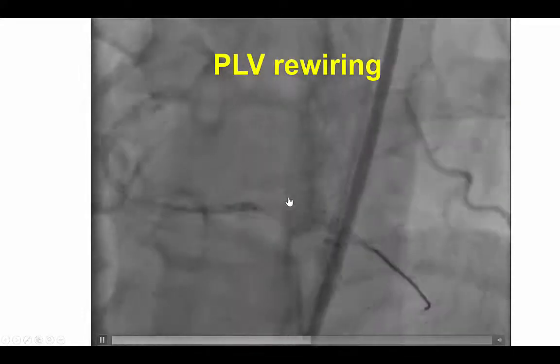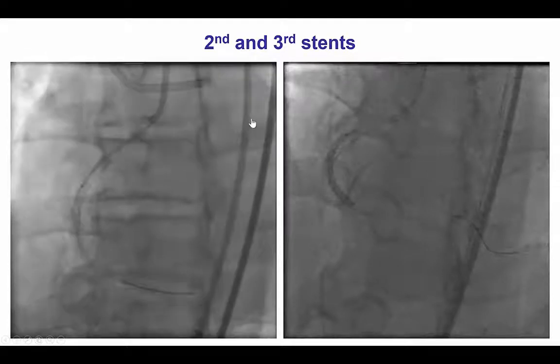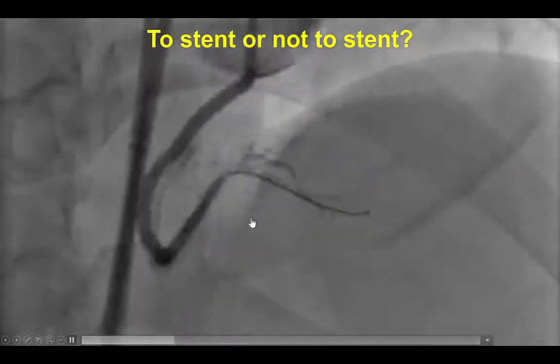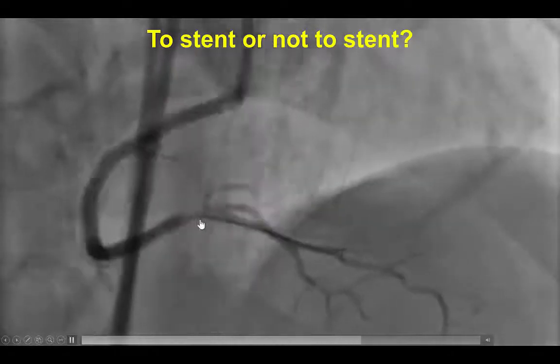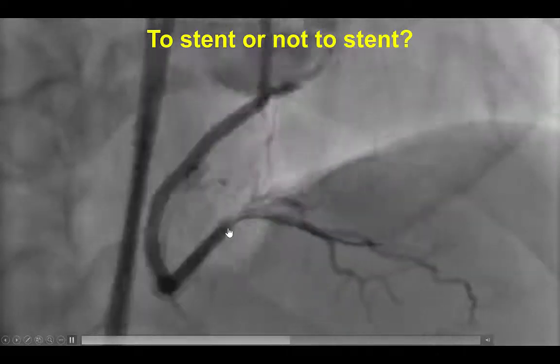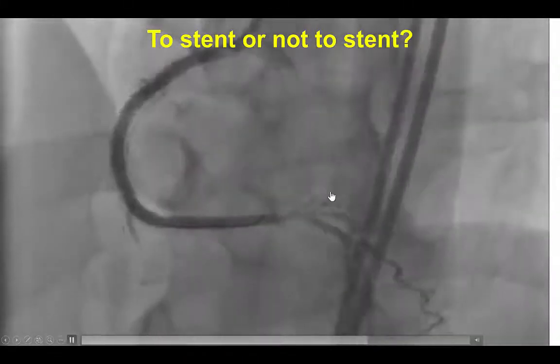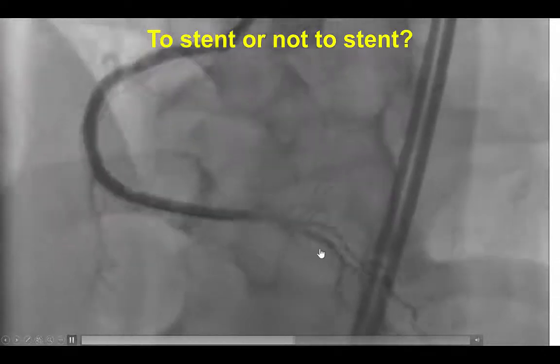We were careful not to affect the distal bifurcation. The stent was deployed, and additional stents were placed all the way to the ostium of the right coronary artery. The result was fairly satisfactory — we did have TIMI flow in both the PDA and the posterolateral vessel. However, in that distal area of the stent there was a large step-down, and there appeared to be some haziness that could be representative of dissection. There was debate on whether we should do something or not; we did an additional view and once again there was good flow, but we were not sure whether there might be a dissection.